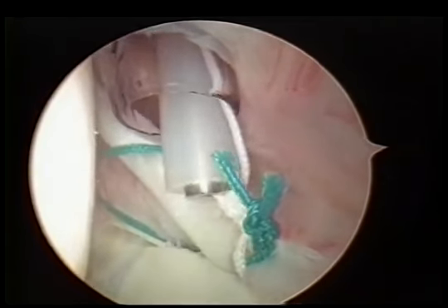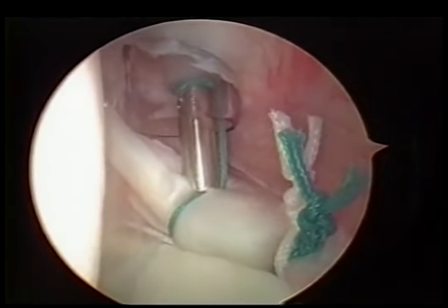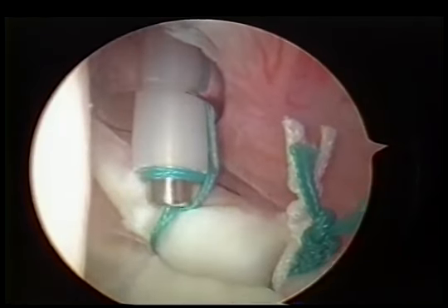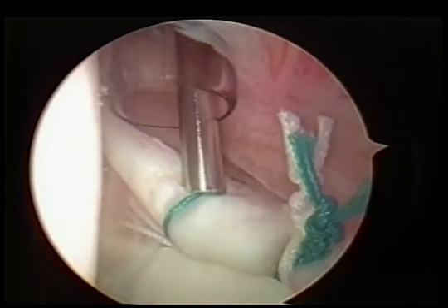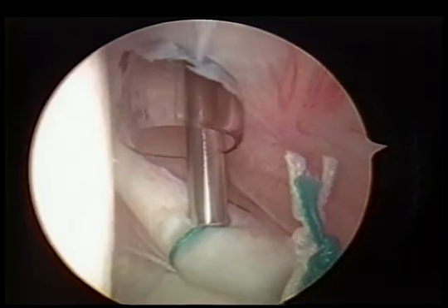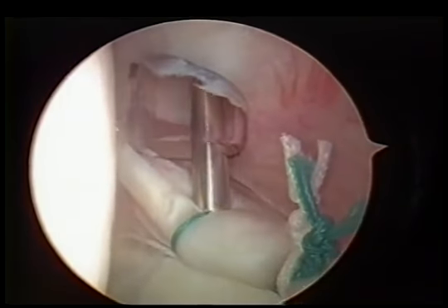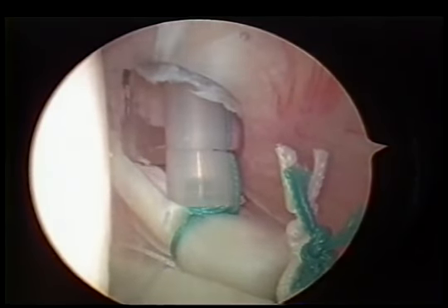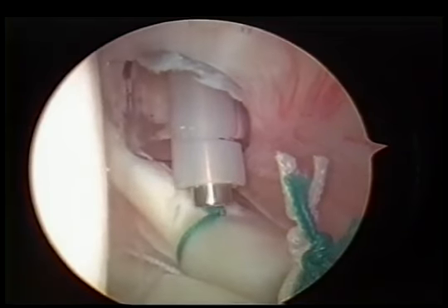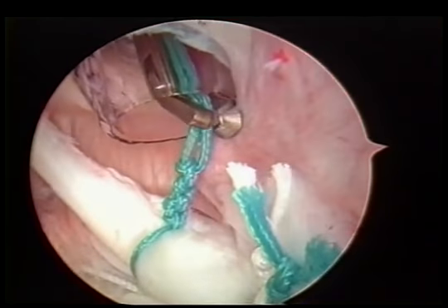You want a pass point to get all the slack out, and you also should consider reversing the posts, which you can do simply by flipping the posts and tensioning your loop suture a couple of times as you go down. This is the most critical loop here, the one that goes over the posterior half of the biceps. This is the one that's going to negate your peel back forces. The clear cannulas help. They give you those added few millimeters of room to work.